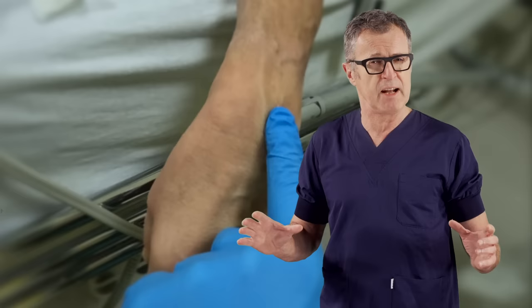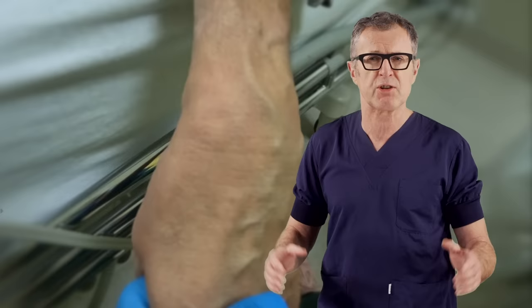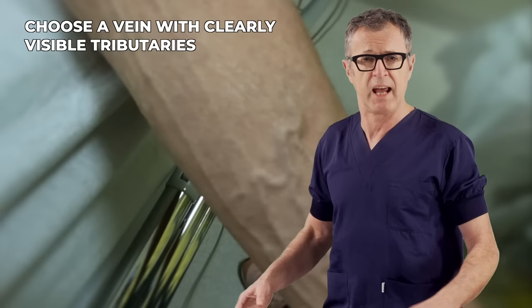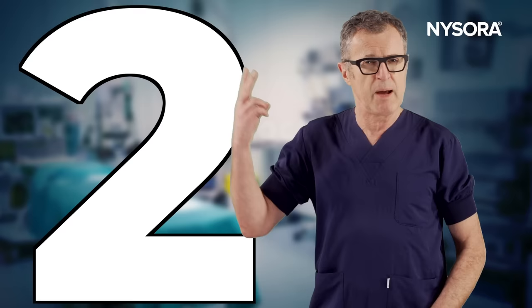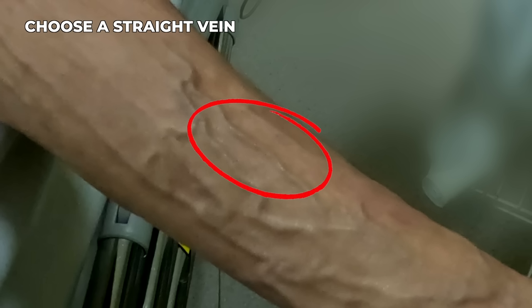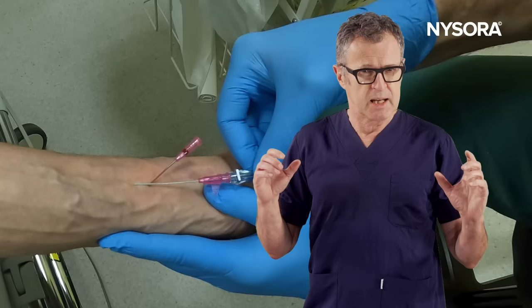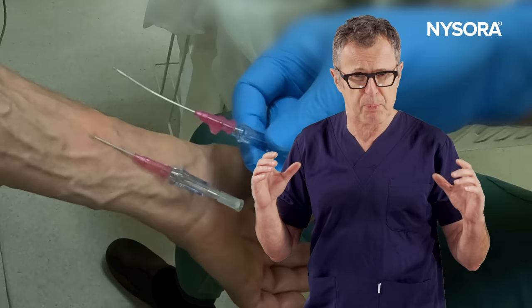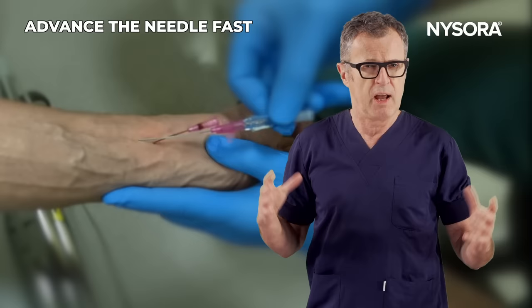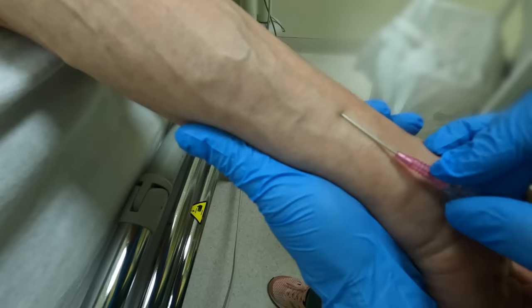When choosing veins like this, it is essential to keep in mind the following strategy. Number one: choose a vein that has clearly visible tributaries, which stabilize the point of needle entry. Number two: choose a vein that is reasonably straight. Number three: keep the angle of needle insertion very low and consider pre-bending the needle catheter to be able to lift the tip up and remain superficial in the plane of the vein. Number four: advance the needle fast to penetrate the vein instead of allowing it to roll off with slow speed.